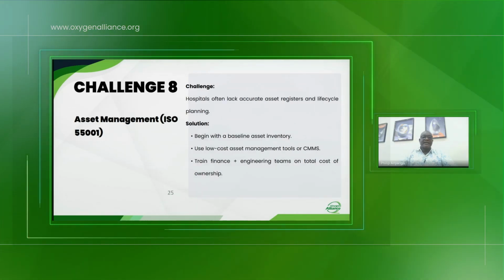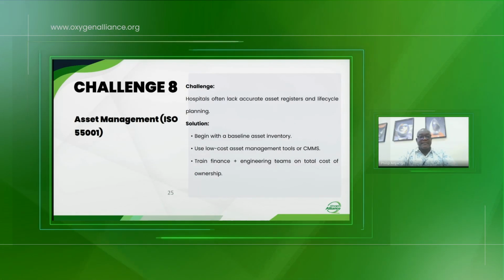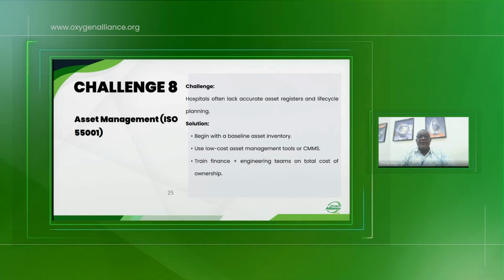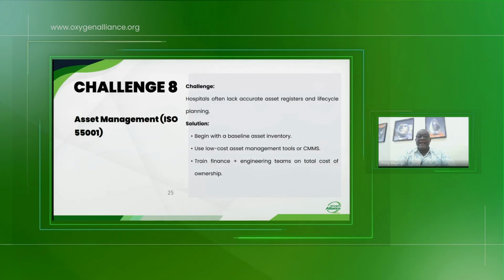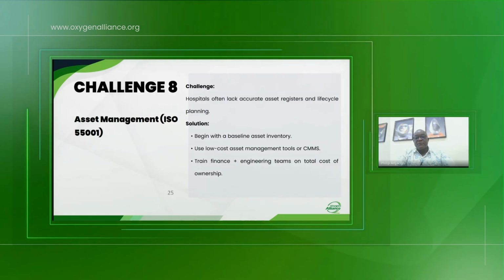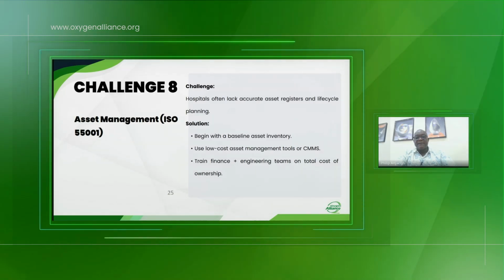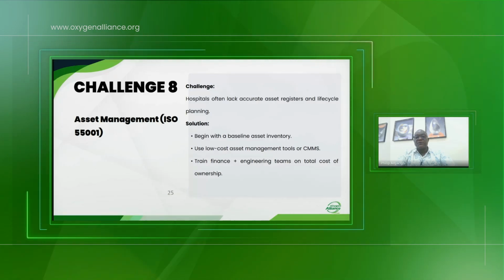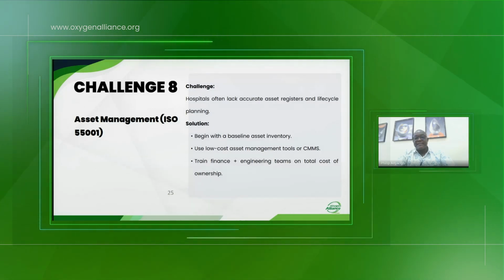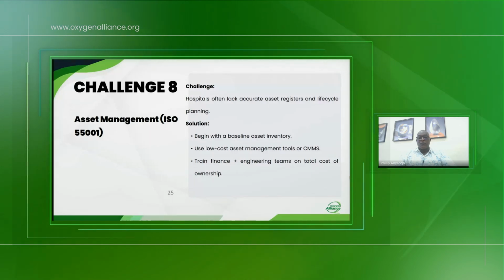Challenge number eight, asset management, ISO 55001. Hospitals often lack accurate asset registers and life cycle planning. So we need to begin with a baseline survey, a baseline asset inventory, use low-cost asset management tools or CMMS, and train the finance plus engineering team on total cost of ownership.